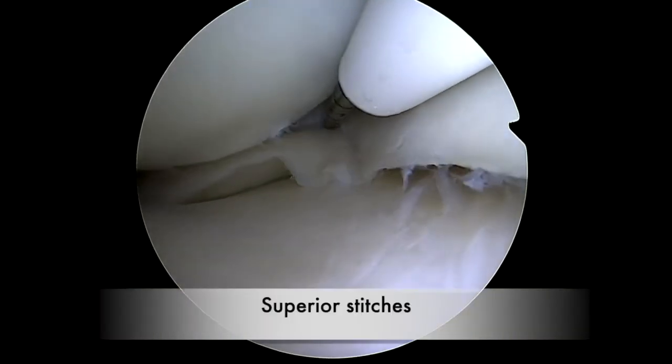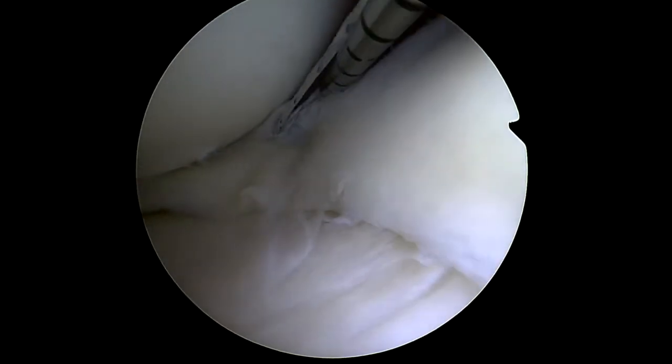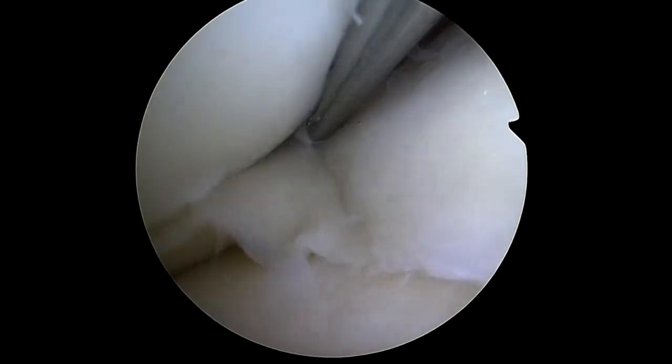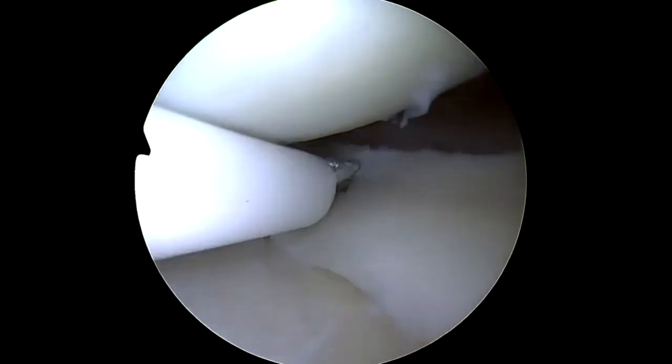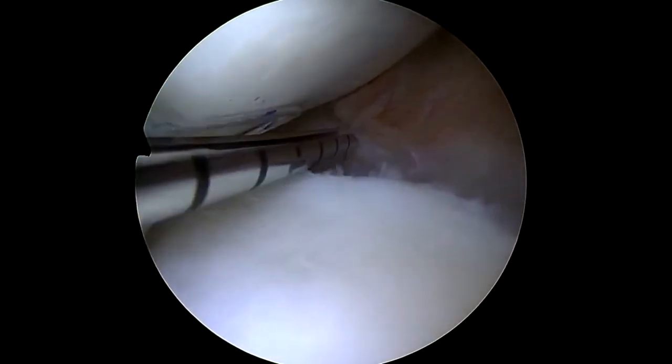A first superior stitch is placed at the posterior limit of the lesion. This stitch, placed in the corner between the posterior horn and the mid-body, is tightened. The scope is then placed in the anteromedial portal and the meniscal repair device through the anterolateral portal in order to have easier access to the mid-body area.